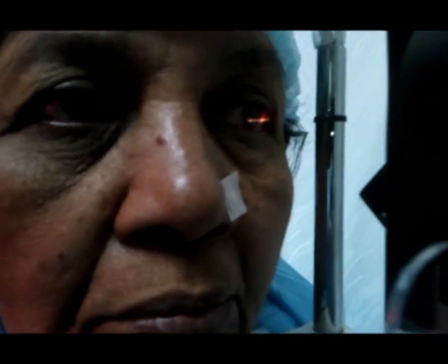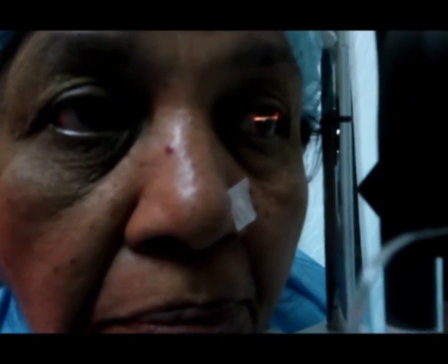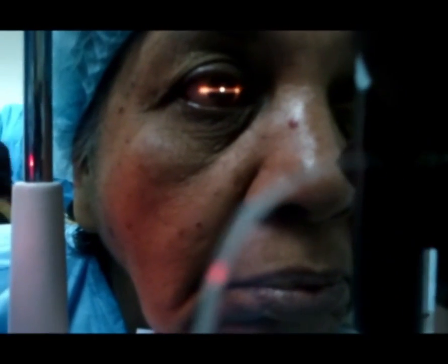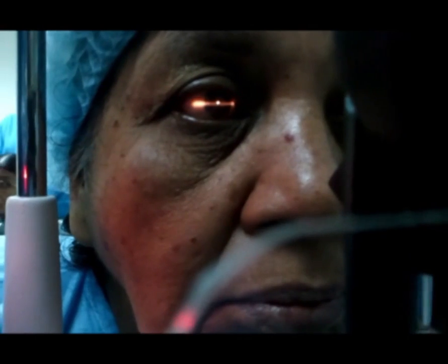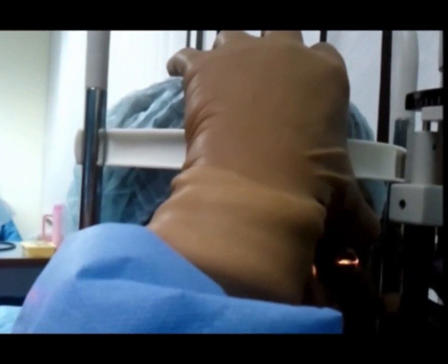Explored the use of Purkinje images on slit lamp to improve the markings preoperatively. While doing so, align the horizontal slit with the Purkinje image in both the eyes to confirm that there is no head tilt before I mark the axis. Thereafter, use the pen to mark the horizontal and the vertical axis on the slit lamp preoperatively.